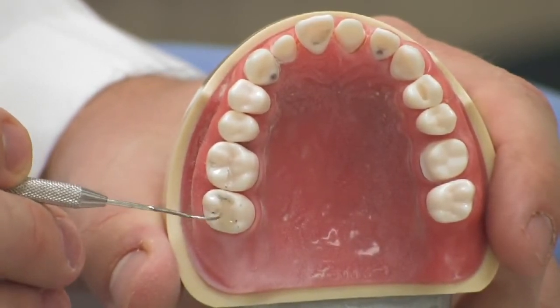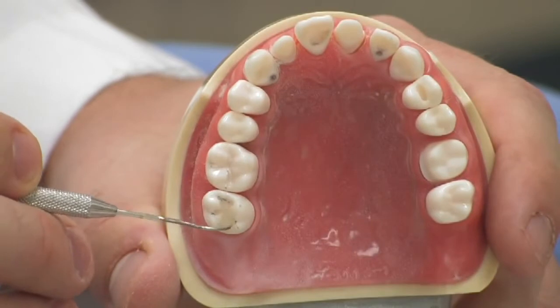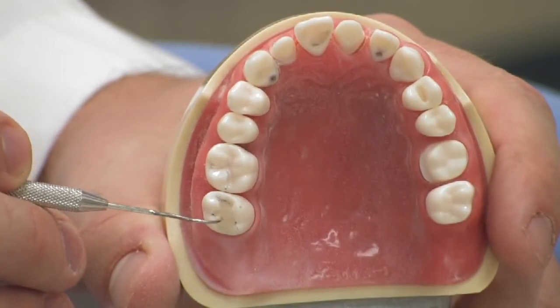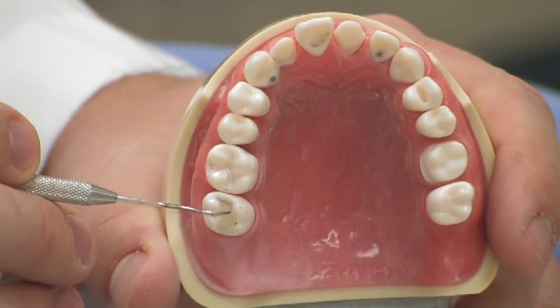Once we verify that the tooth has been filled, the last step is to go in and check the bite to ensure that the patient is not biting heavy or hard on this tooth. And that is pretty much a filling.